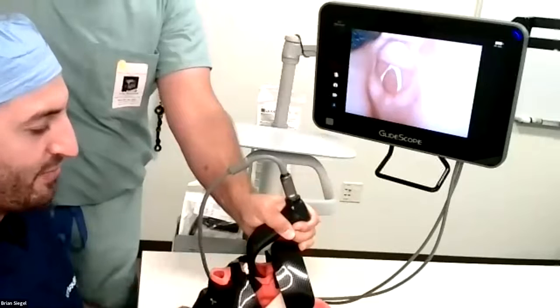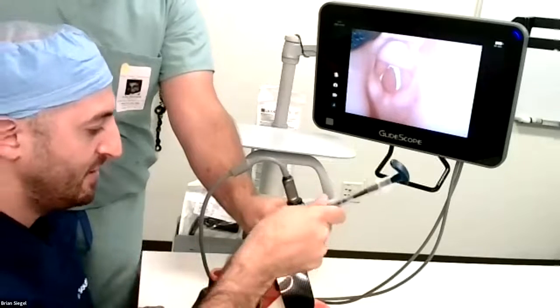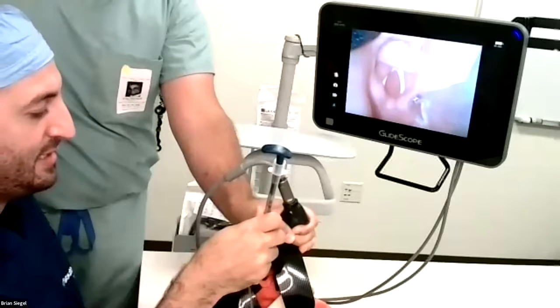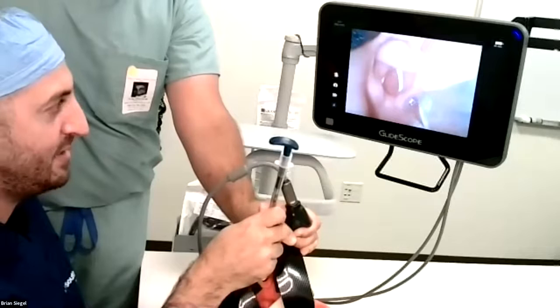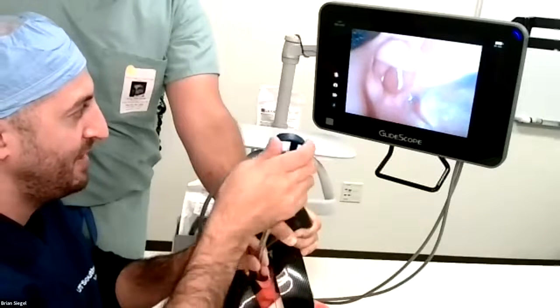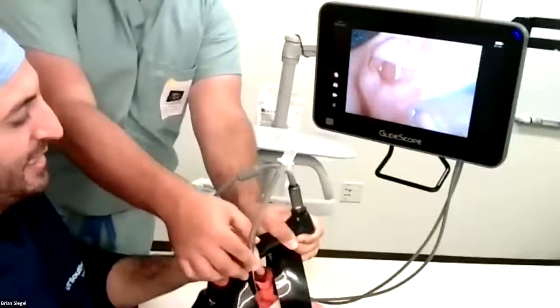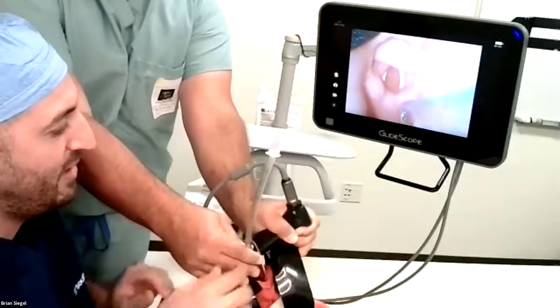Now that I'm ready to pass the tube — I've got it in view here — but let's assume that the glottic opening was too anterior to actually direct my tube there. I'm going to stop right here, pull my stylet out, and ask my assistant to take the tube. I can position the tube however I want once we're there.